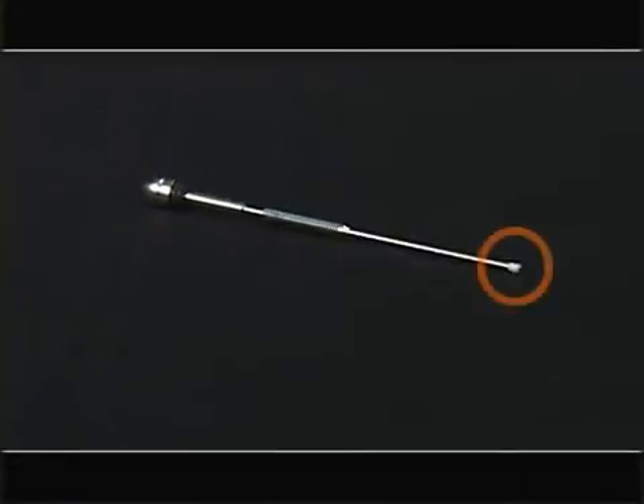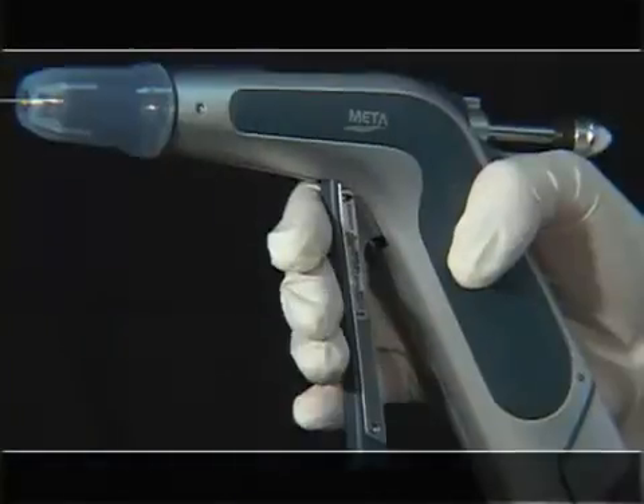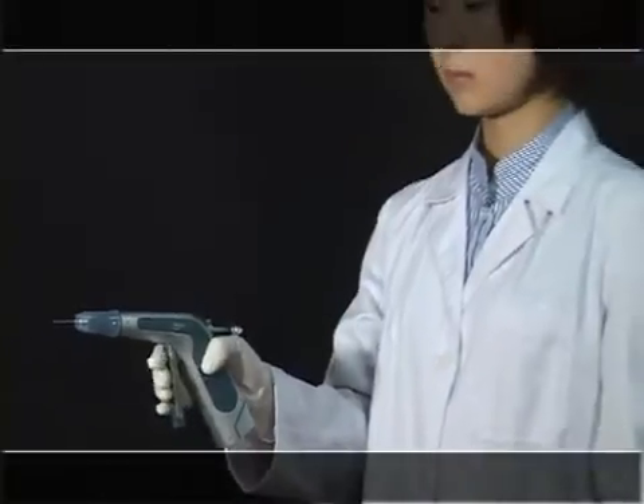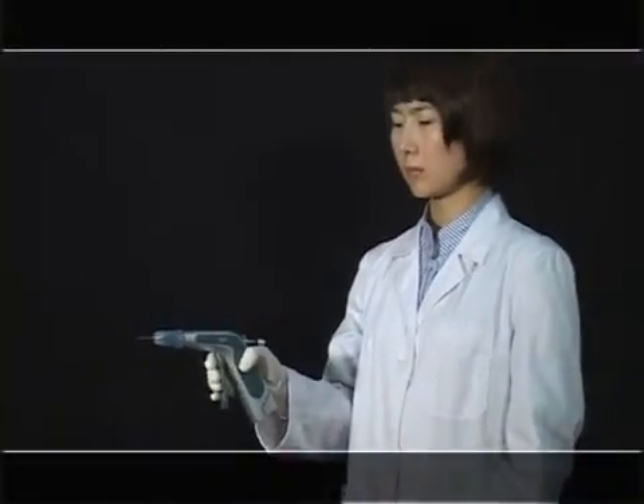The plunger head protects Gutta-Percha from flowing back. If you pull the trigger once, the plunger will move forward by 2 millimeters. It is designed to push the softened Gutta-Percha.